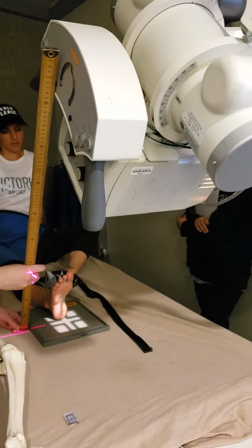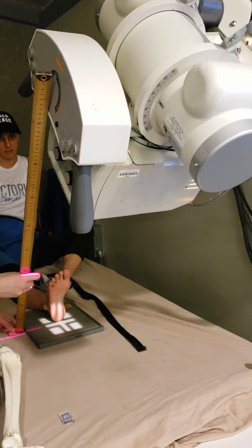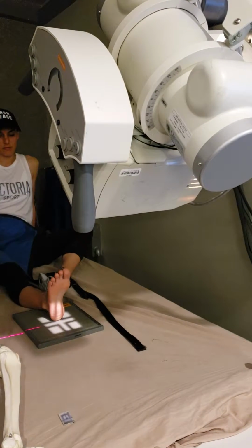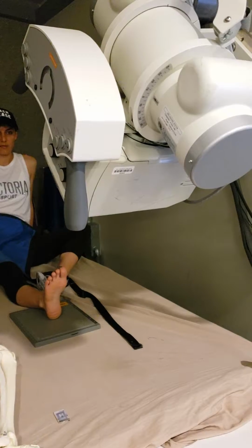So now I'm just going to move her to the center. What you don't want is your tube way over here. The only real problem with that is you have to go up in your technique if you go up in your distance.